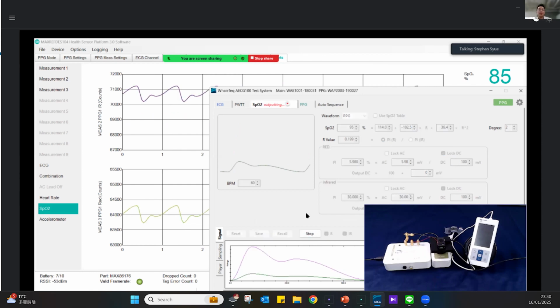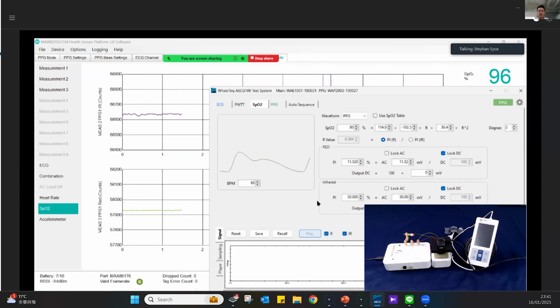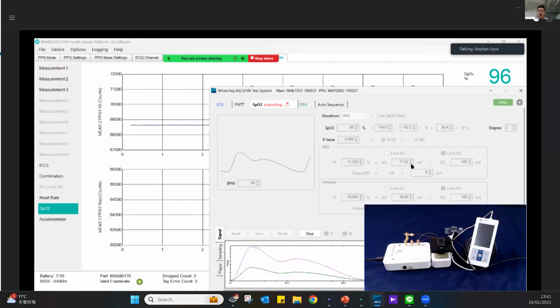We just wait a few seconds for the reference design 104 to respond to the new signal. Yeah, it's 1% off. Great. We can also drop down to 85, or let's go to 80, just a little bit extreme. So here along the curve, the AC is tuned up.